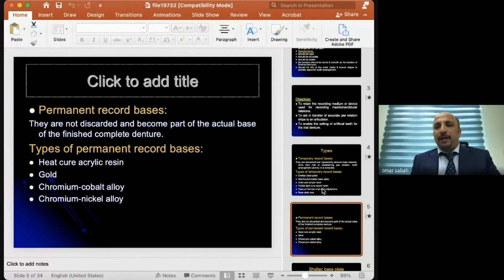God willing, I will explain the procedures to you; we were in our time at the same stage as you, and at this stage we made it by our hands and you can make it in your homes too. The types of permanent recorded base are hot cure acrylic, gold, chrome cobalt, and nickel alloy.